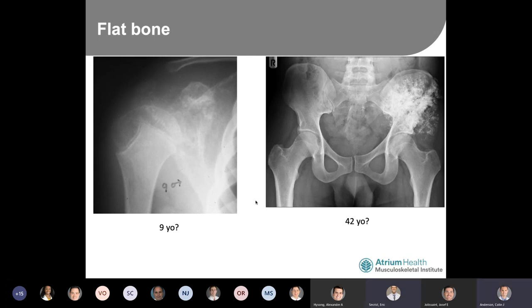What about the scapular spine or the acromion? Kind of not there, right? Yeah. What do you think? Yeah, decreased bone density throughout there too, I guess. Well, I know decreased bone density is the word, but I would say this is more concerning for bony destruction. Okay, yeah. It almost looks kind of moth-eaten or permeative if you try to focus your eyes on it. Well, I admit it's not the best X-ray.